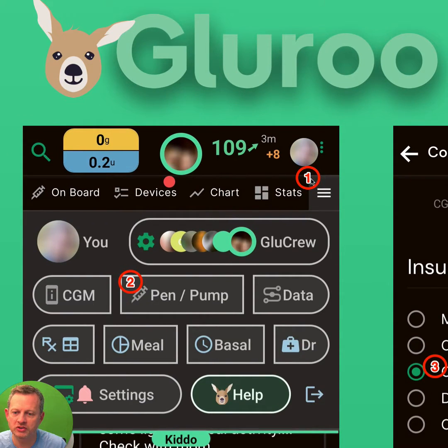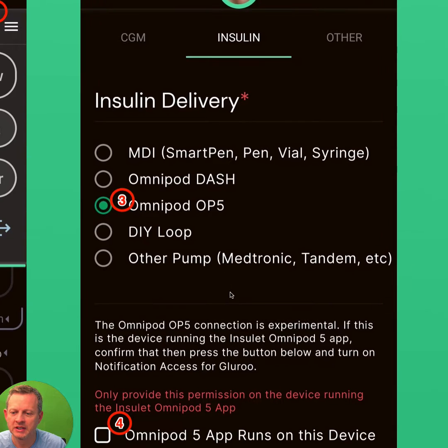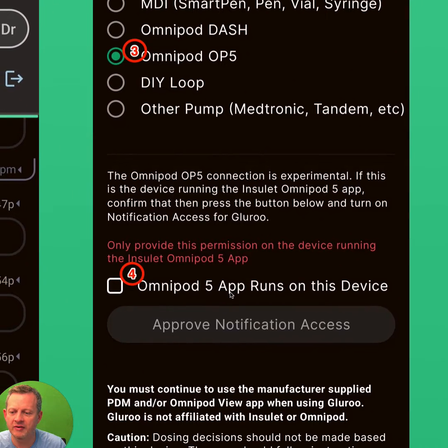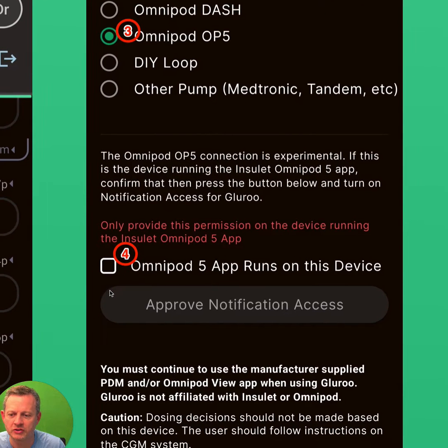on that same phone, you start GlueRoo, set up your Glue Crew, then tap the menu and choose Pen/Pump to choose your insulin delivery mechanism, select OP5, and then you'll have to assert that this is the same device running the OP5 app and GlueRoo.